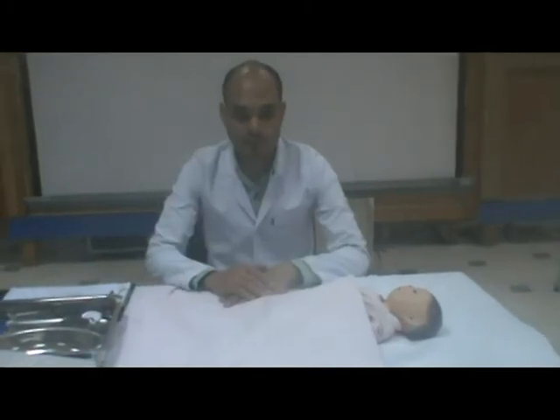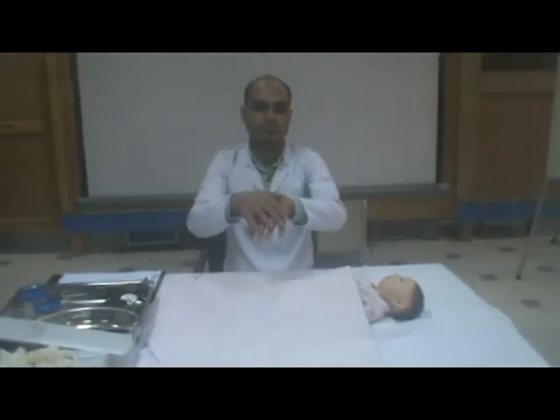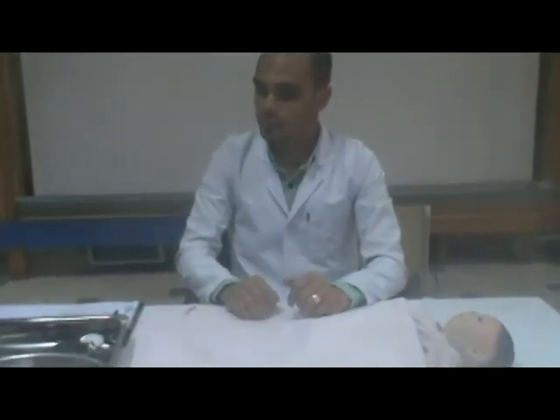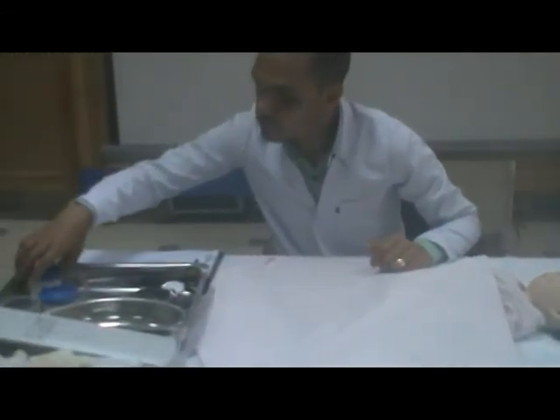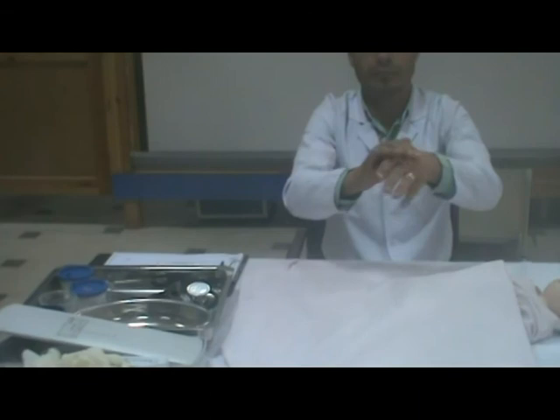Axillary temperature. Steps. Wash hands to reduce transmission of infection. Prepare all needed equipment to save time and effort. Wash hands to reduce transmission of infection.